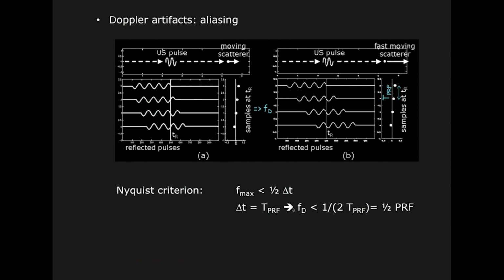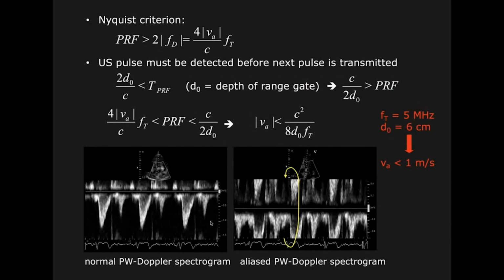And then, as we said before, aliasing is another artifact which is typical of Doppler. And when we look at this, it seems like velocities are being mirrored. So when you see something there, what you would hope is you have a nice profile of the blood being accelerated and decelerated through a valve. You see this kind of thing where we have half of the signal at the other side of the image. So that's actually because of this.